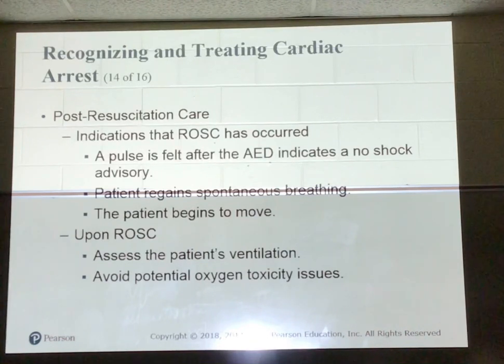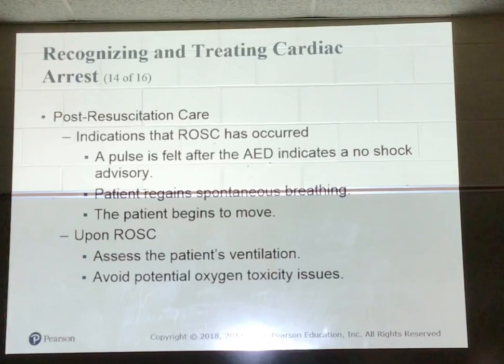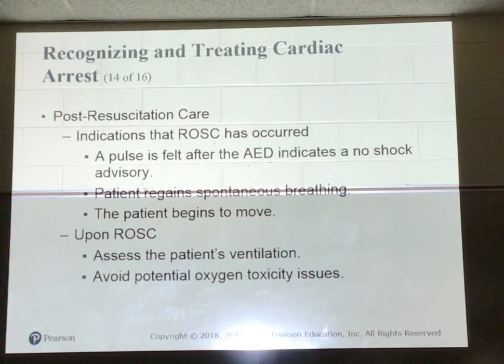During cardiac arrest, oxygen is applied to the ventilation device and delivered in a manner to provide the highest concentration possible, up to 100%, to the patient. After the patient has regained a pulse, AHA guidelines recommend oxygen delivery be reduced to the minimal liter flow to keep their SpO2 at 94% or higher.